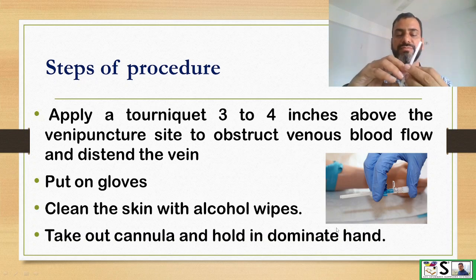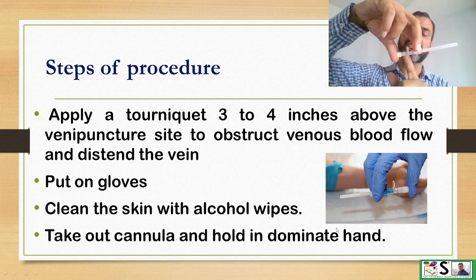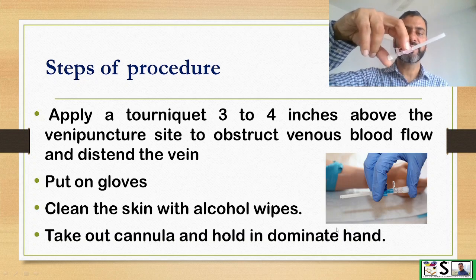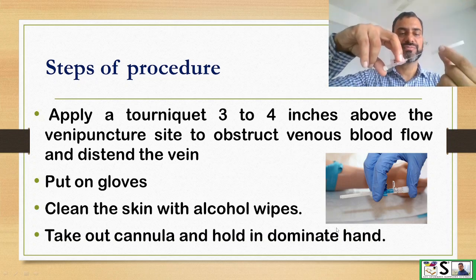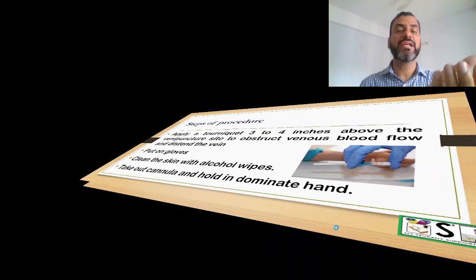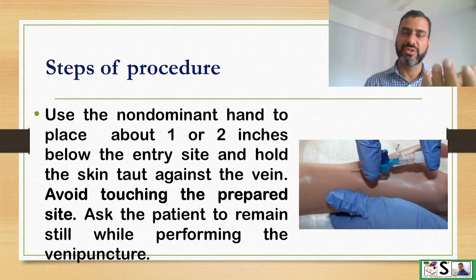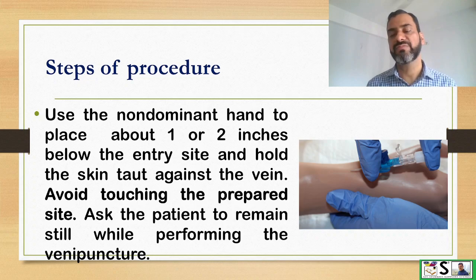Hold the cannula properly so that your thumb presses here to prevent the needle from going back. Just before piercing, remove the cap. Your non-dominant hand will hold the patient's arm below and taut the skin so that the vein is stabilized. Avoid touching the prepared site because that should remain sterile. Ask the client to remain still while performing the venipuncture.